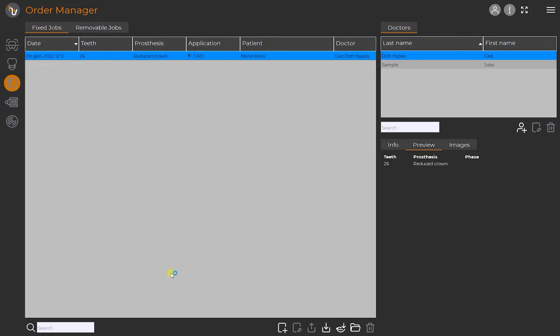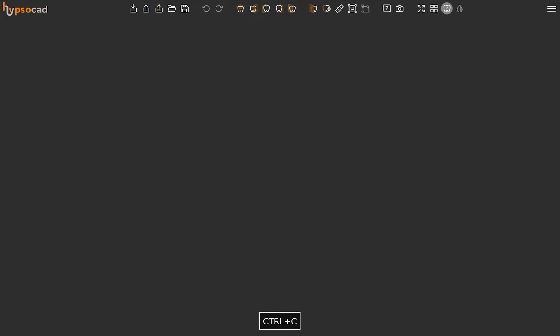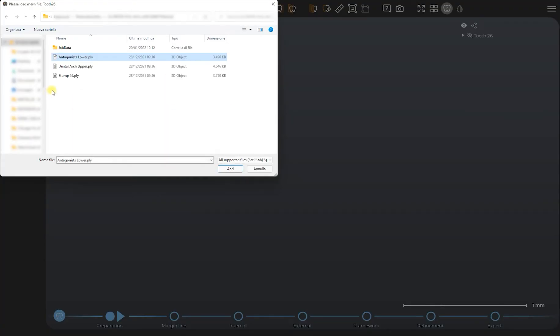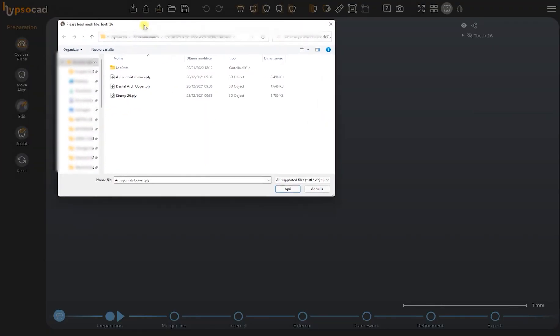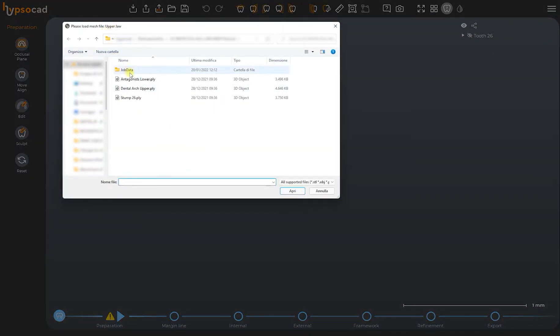At this point the process for the scans upload will start. The software will open a folder in which we should copy paste or drag and drop the scan files to be used in order to achieve this prosthesis.